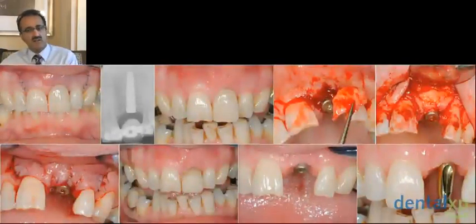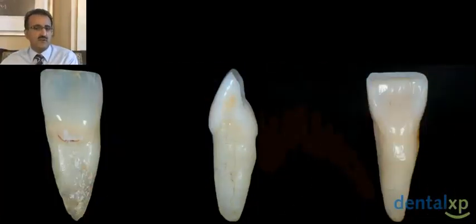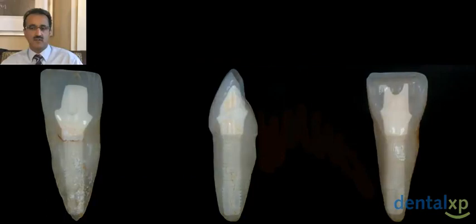And then we design our abutment, because of course a tooth looks like this, but our implant abutment is different. It's not like in the old days where we used to have these divergent components. Now we want to have narrow, concave, transmucosal components, and then late flaring to the shape of the tooth to create our emergence profile. This maximizes the volume of tissue by keeping the components narrow in the apical region and transmucosal area. We want to support our papillae, of course. So it's important to get that right.